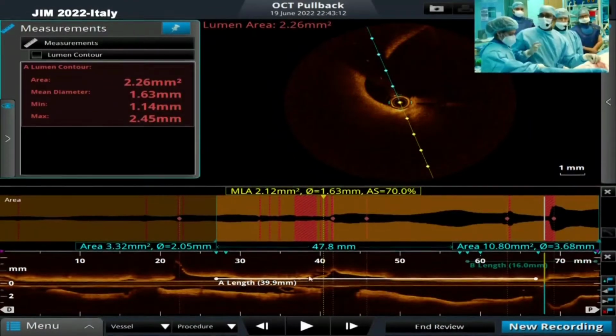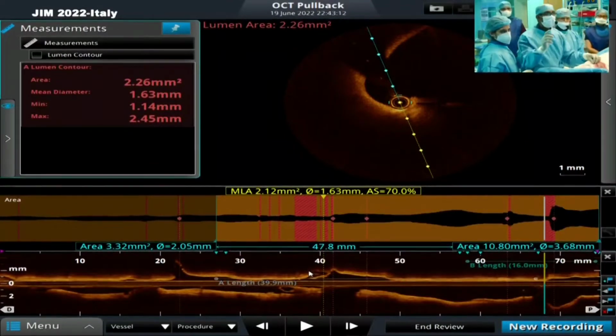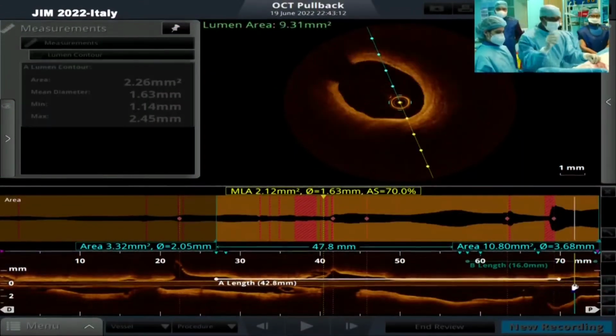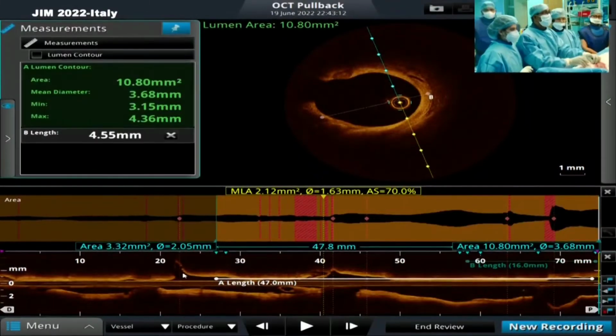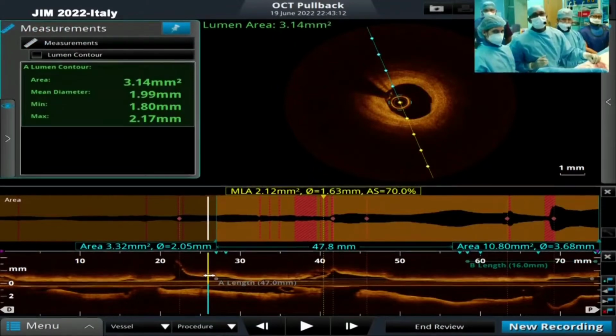That's what I wanted. Yes, that's what I'm interested in, because I have an alternative stenting technique to propose to you: to stent only from ostial LAD and on. Just show the length from the ostium of LAD till the diagonal ostium, first diagonal. That's what makes a good discussion, to have alternative options. So you would want to avoid the left main stenting, is it?